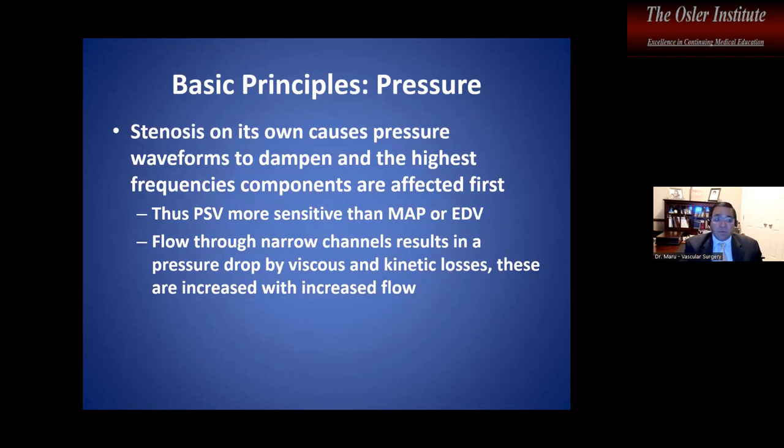The basic idea behind this is that stenosis causes a pressure waveform to dampen, and the highest frequency components are affected first. So whenever you look at something, especially carotids, which we analyze all day long, the first thing I look at is peak systolic. It's more sensitive than the mean or the end diastolic. The flow through the channel results in a pressure drop by kinetic loss, and these increase with flow.